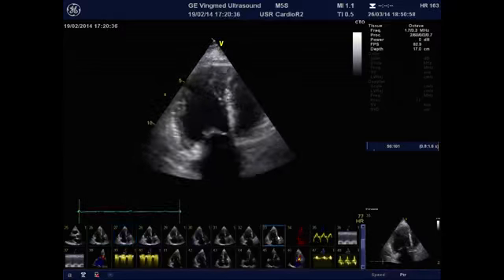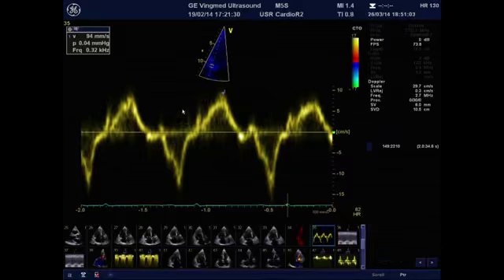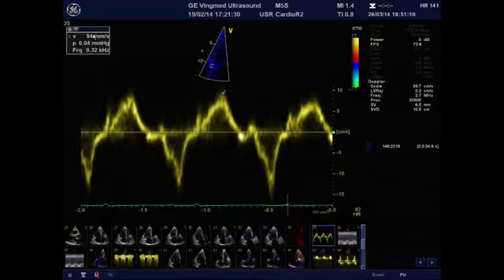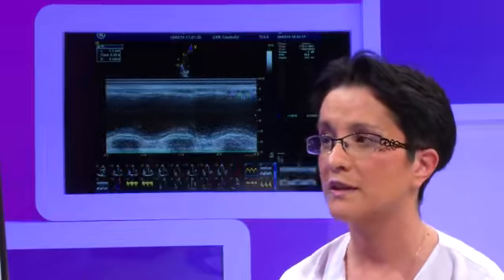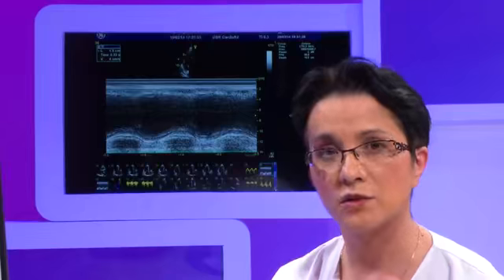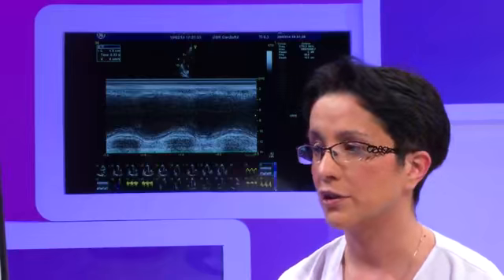which we can confirm not only by looking at it closer, but also by measuring the systolic peak velocity of the tricuspid annulus in myocardial pulse wave Doppler, which is 9, being below 11, showing a dysfunction of the right ventricle, and also by TAPSE, which is 15 millimeters, again decreased. So this shows the case of a patient with severe pulmonary hypertension associated to scleroderma and leading also to a depression of the right ventricular function.